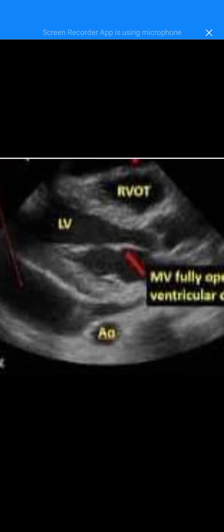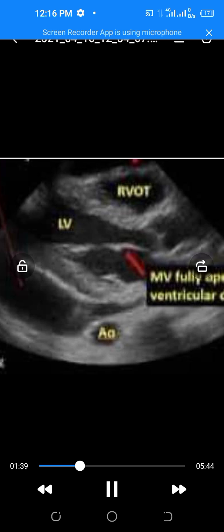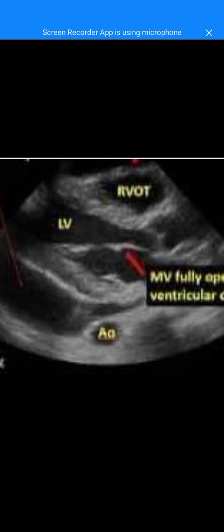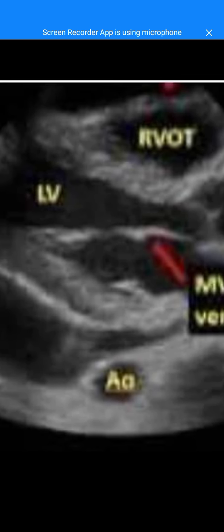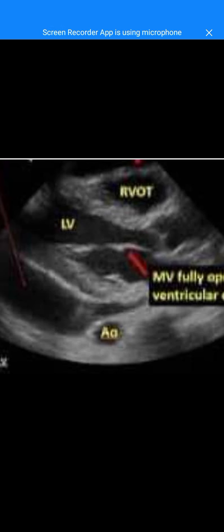What type of aorta is that? It is the descending thoracic aorta. So the fluid and echo-free zone that lies anteriorly to the descending thoracic aorta, that is a pericardial effusion. And any echo-free zone that lies posteriorly to the descending thoracic aorta, that is a pleural effusion.